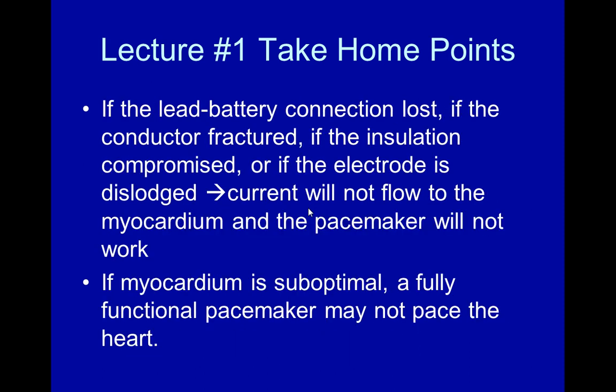If the lead battery connection is lost, or if the conductor is fractured, or if the insulation is compromised, or if the electrode is dislodged from the heart, the current will not flow to the myocardium and the pacemaker will not work. And that's the framework you want to think about whenever you have a pacemaker problem: think systematically of what things could go wrong to prevent the pacemaker from working. Now, even if the pacemaker is working perfectly, if the myocardium is suboptimal, a fully functional pacemaker may not pace the heart.